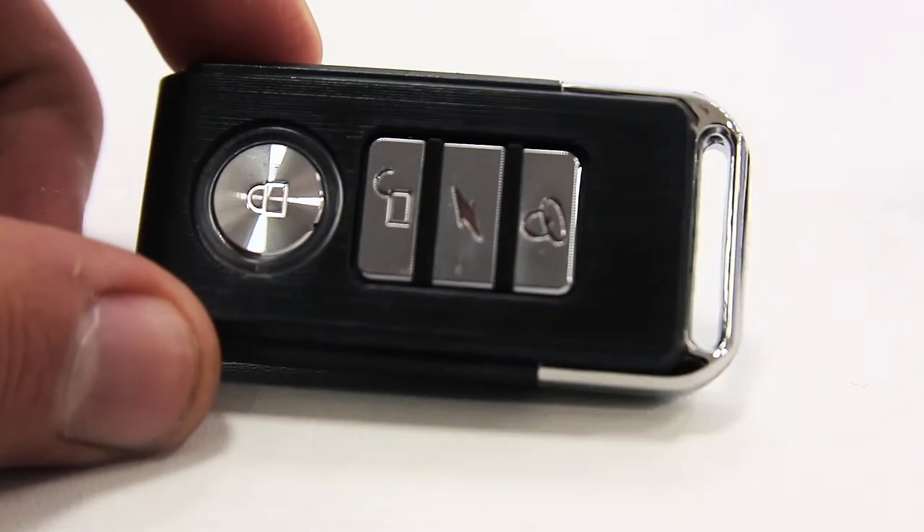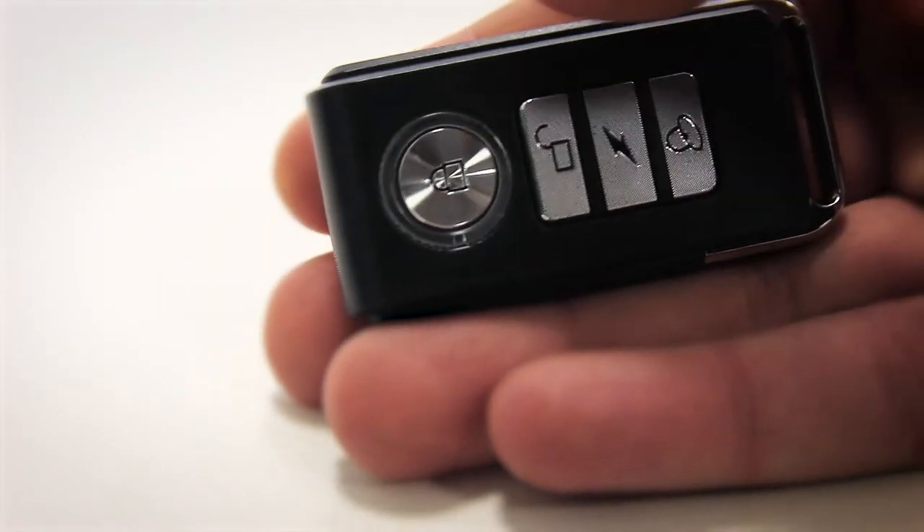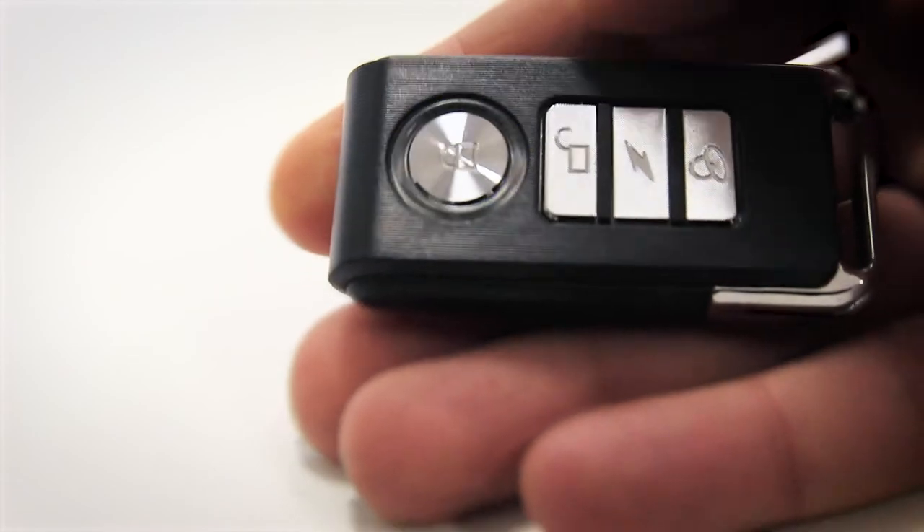You can arm and disarm the scooter using this small remote, and there are even controls to change the alarm sound.